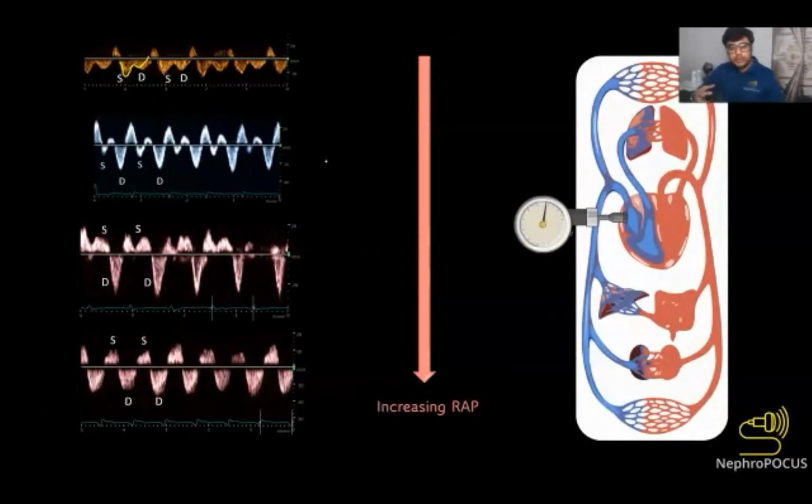You can imagine that better if you think about tricuspid regurgitation. And mostly fluid overload is associated with some degree of functional tricuspid regurgitation. So what happens during this regurgitation? During systole, when the tricuspid valve normally closes, because of the regurgitation there is more blood going back into the right atrium, and that's offering resistance to the systolic wave. The systolic wave then becomes smaller in amplitude compared to the diastolic wave, altering the normal configuration. So in this example here, the systolic wave is smaller than the D wave.